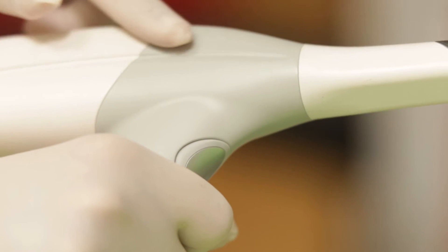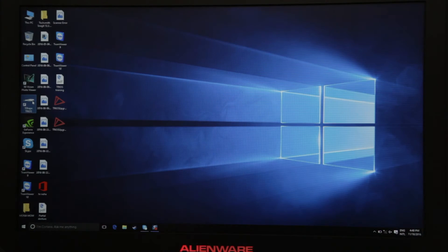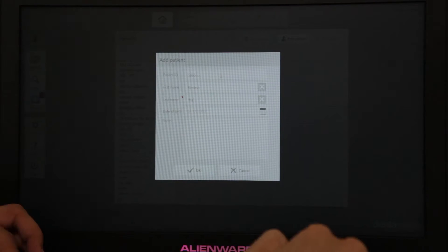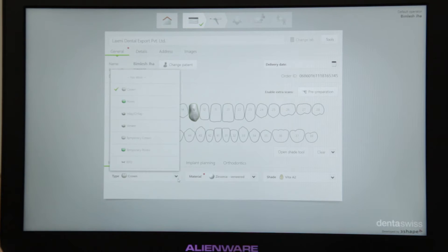This is the scanner which can do all the magic for you. The scanner has a button right here — when I push it, it will activate the scanner. It is connected to a computer where we can see all the scanned impressions. The first step is to create a file for your patient. You can select what tooth you are going to scan and also what product you need to order for your patient. This is almost like a digital prescription where you are giving all the data that the lab needs to process your order.